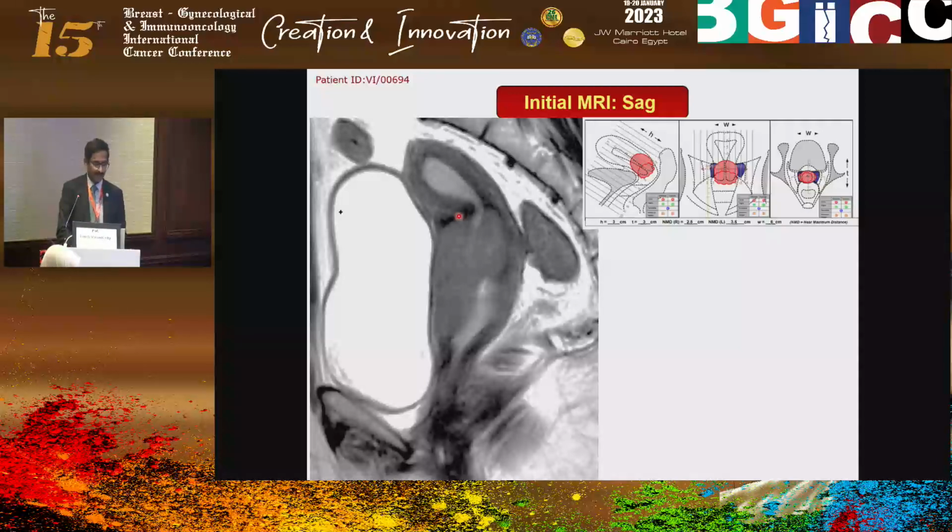So it means the remaining part of the cervix is replaced by this tumor. But at the top, at the junction of cervix and uterus, the normal cervix is not involved. So there is a rim of normal cervical tissue at the level of the isthmus. So what it means is it is not going into the uterus, right?